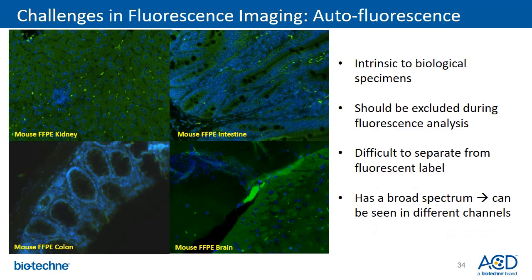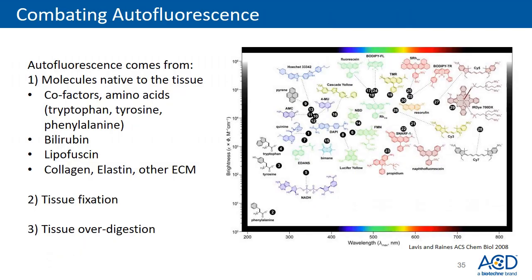One of the main challenges in fluorescence imaging is autofluorescence, which is intrinsic to biological specimens and should be excluded during image analysis. However, this may not always be easy, as it may be difficult to separate autofluorescence from real fluorescent signal. One way to distinguish autofluorescence is to check if the same signal is present in different channels, because autofluorescence usually has a wide spectrum making it visible through more than one channel. Autofluorescence may come from many different sources in tissues, including cofactors, amino acids, bilirubin, lipofuscin, collagen, and elastin.